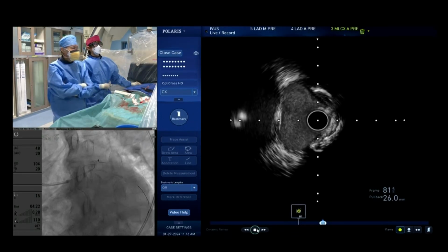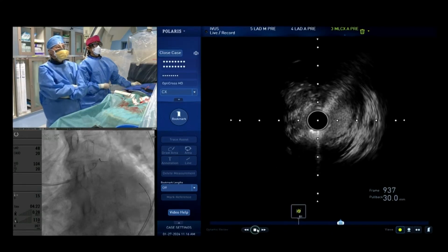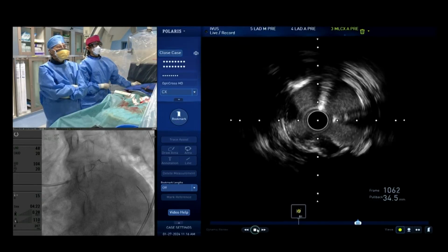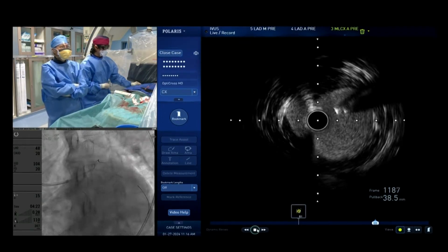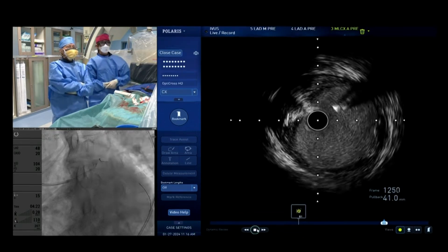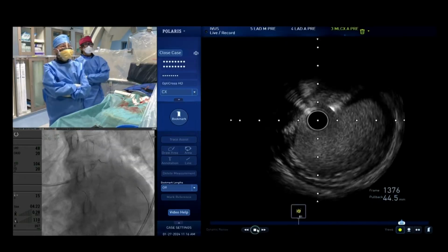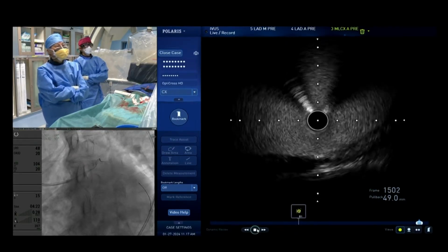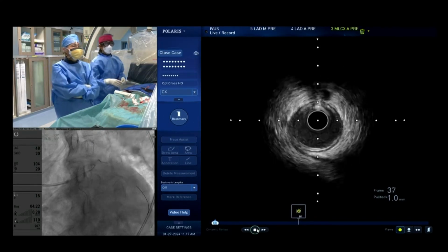We are coming to the ostium right now, so you can see the ostium looks fairly all right. I'm not sure if everyone caught that. There's an area of borderline lesion somewhere after the high OM, somewhere in the mid circumflex, but I think we're going to elect to leave that alone for today. There is a lesion in the mid left main, but on IVUS it's actually just an outpouching. It's not really anything serious, so we're not going to do anything to it, but probably stent it.